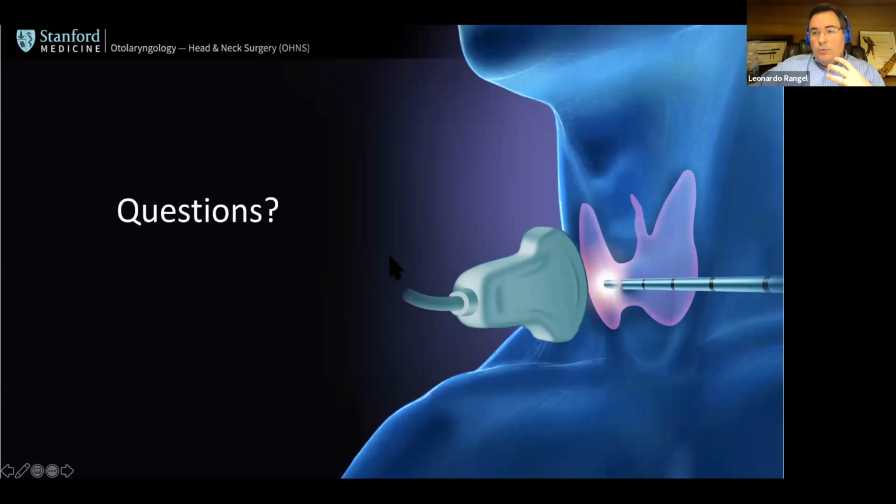And the patient cannot move, because you program the area you're going to ablate, then you start the procedure. If the patient moves a little bit, the machine stops. So it's not that easy. Radio frequency is actually the most available source of energy. As Julia said, it's used on liver, kidney, bone. So it's the same equipment, you just change the electrode. You should have one for your clinic, for your hospital. It's just a matter of using the right electrode for the thyroid.